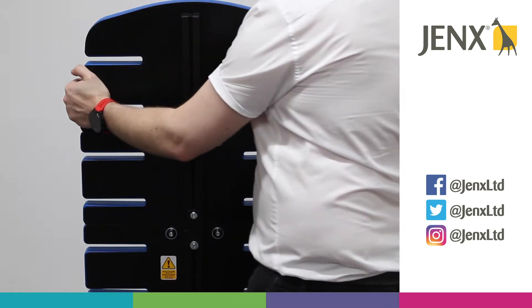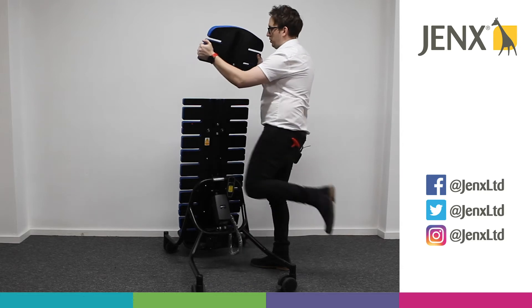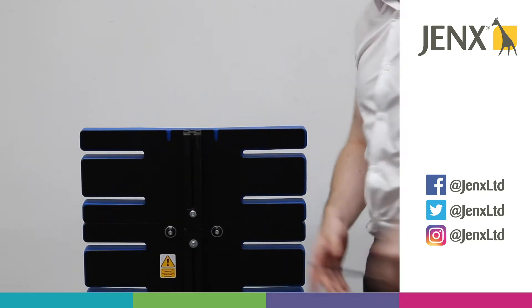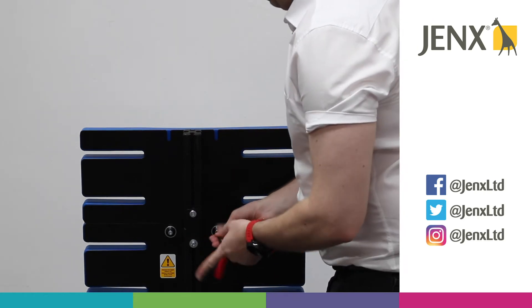Now simply lift the support board off, and we can do that again with one more support board.